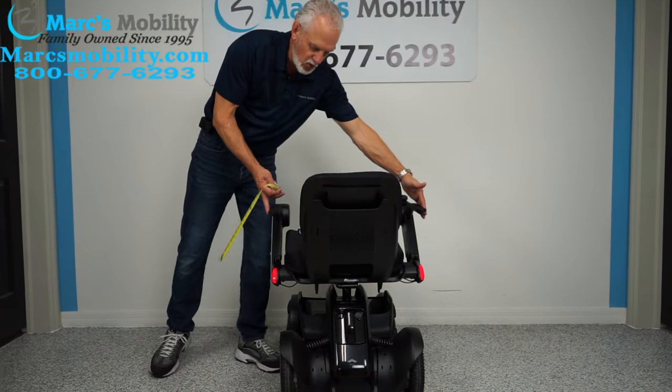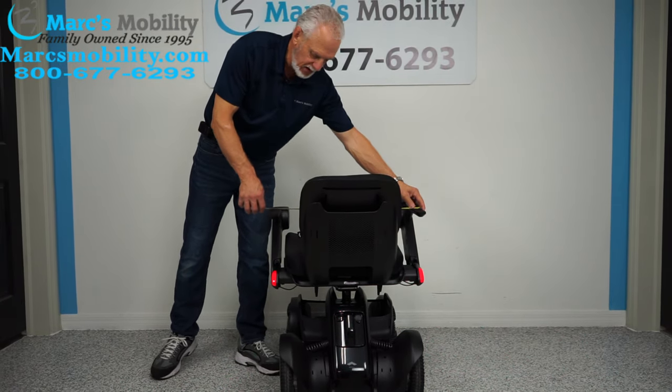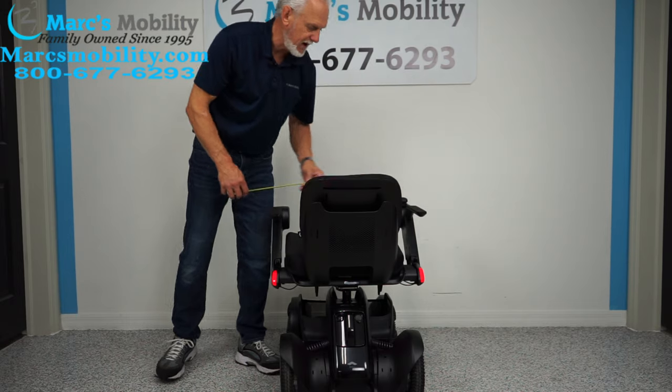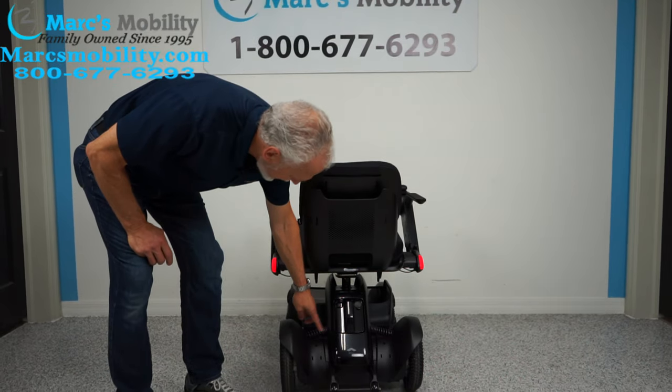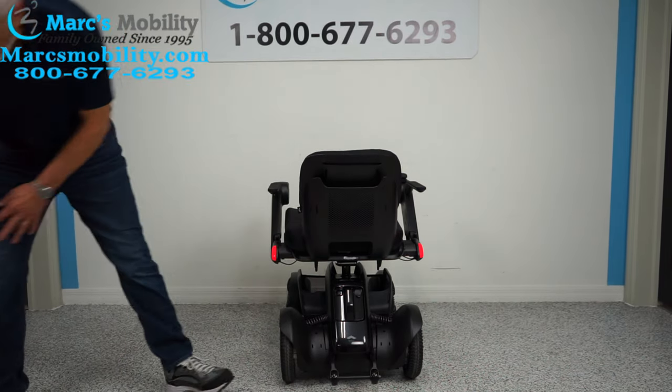You still have to go through a door with these arms, so with smaller seats the arms are going to be closer together. You can see the suspension in the back right here for each wheel, and you can see the anti-tip wheels right here, which is nice.